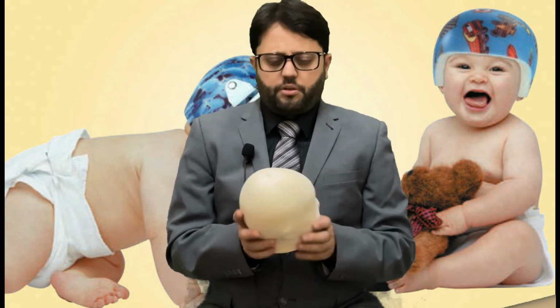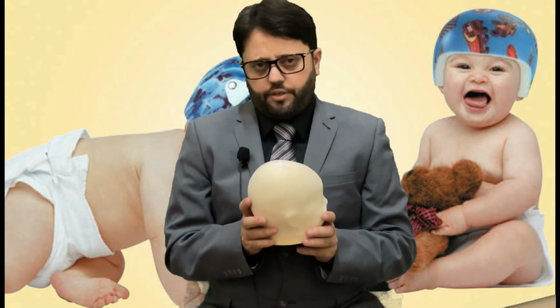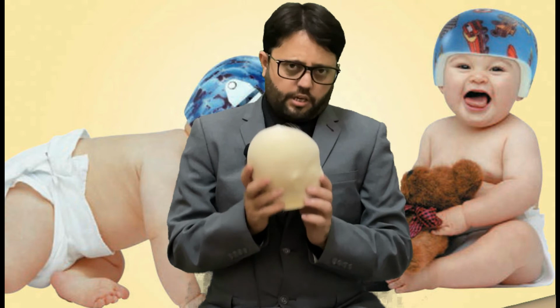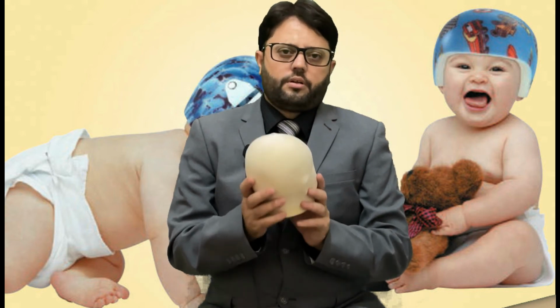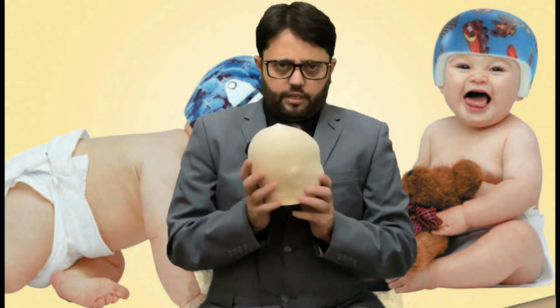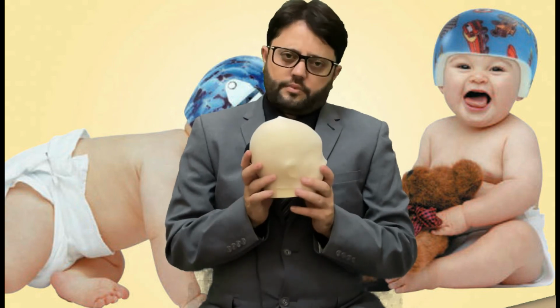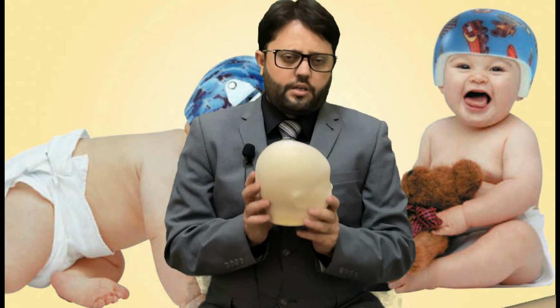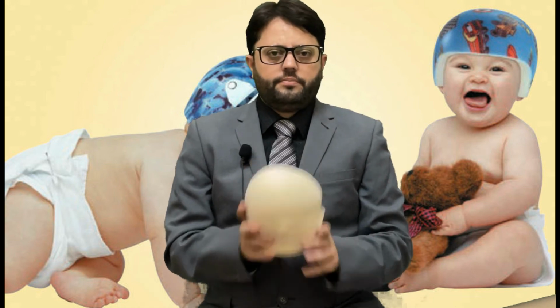Once the patient is already 1 year or 1.5 years old, there is no chance to correct the head shape by a cranial remolding orthosis. In that case, surgery will be the last option. We will not have any conservative treatment.